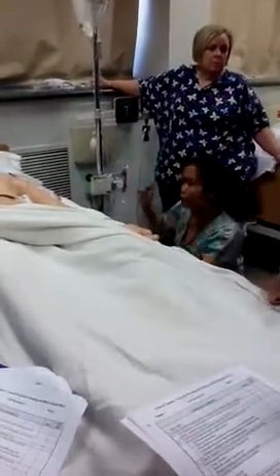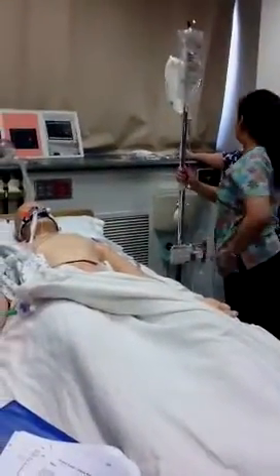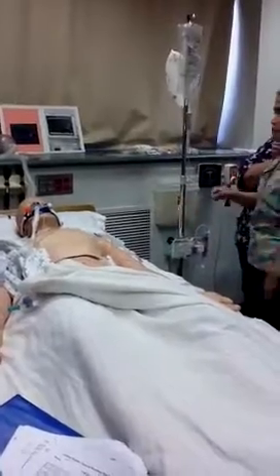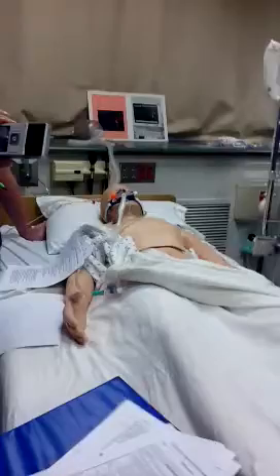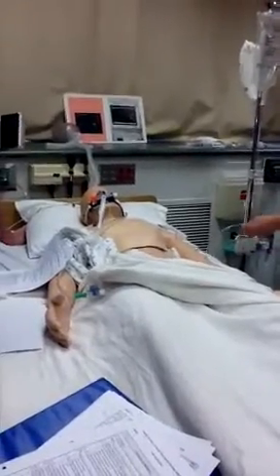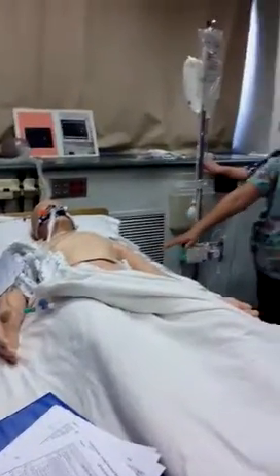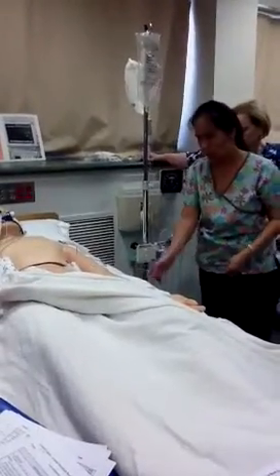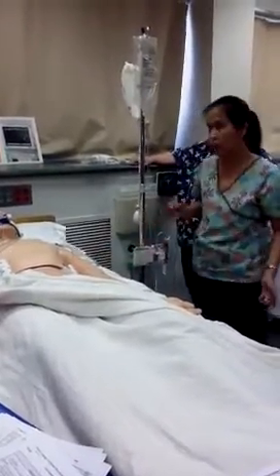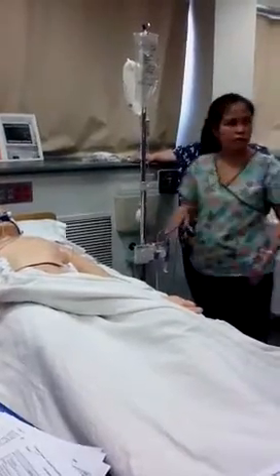You use a leveler. There's a leveler. There's one here. It's just a yardstick. At CRMC, there's always one in each room. There's a leveler, and critical care nurses actually have their own levelers.